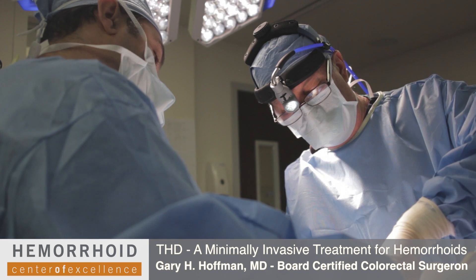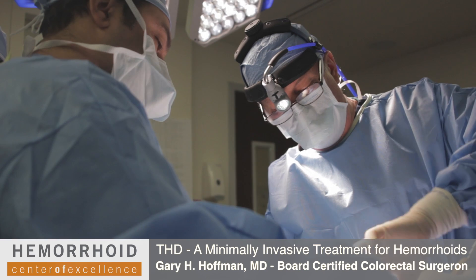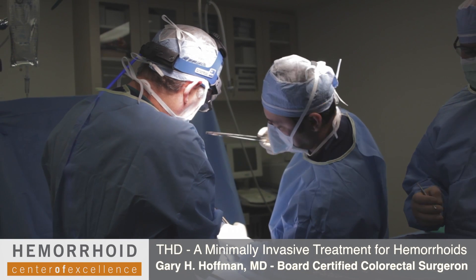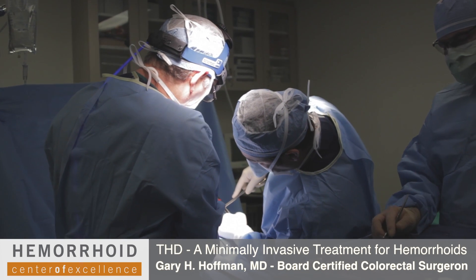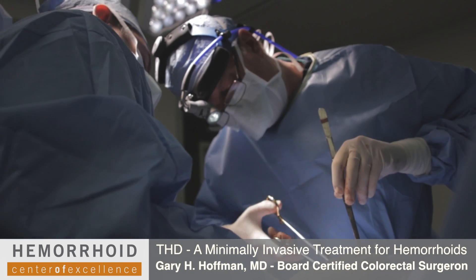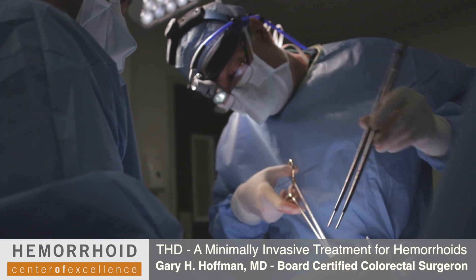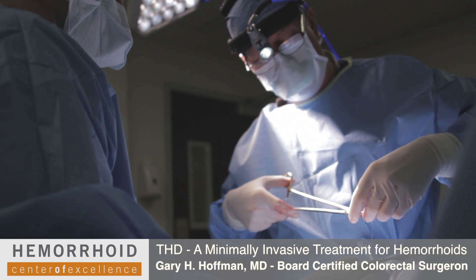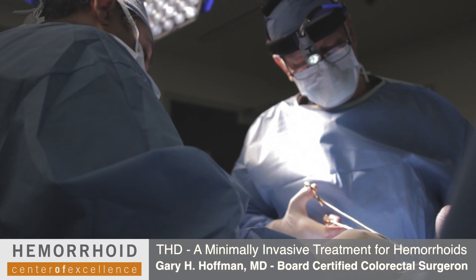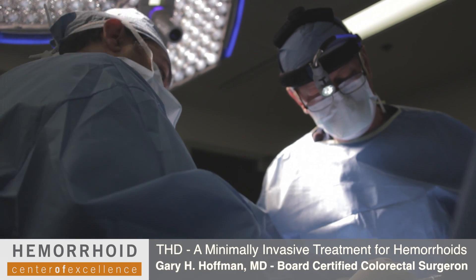Patient selection is very important, and the operation needs to be tailored and individualized given each patient's clinical situation and anatomy. The arterial inflow on this side is less strong, corresponding to this hemorrhoid being slightly smaller. THD, because each area is treated separately, takes a little bit longer than PPH. It's just the nature of the procedure and not a benefit or a lack of benefit. Each procedure is performed individualizing it to the patient.